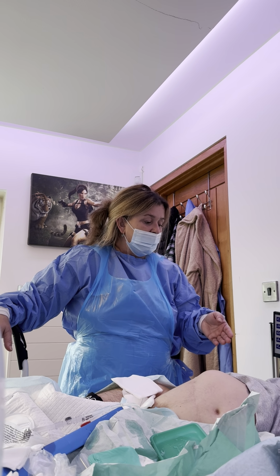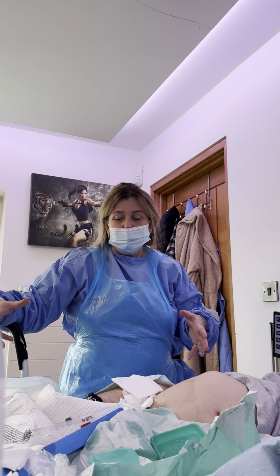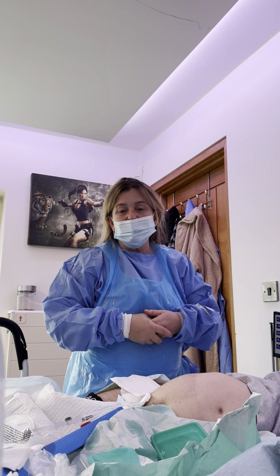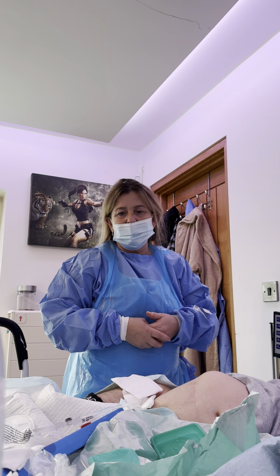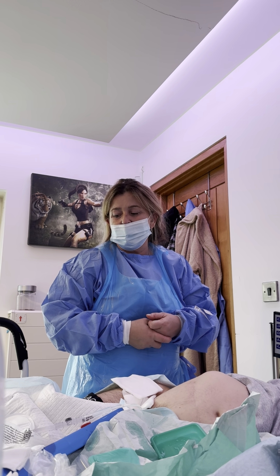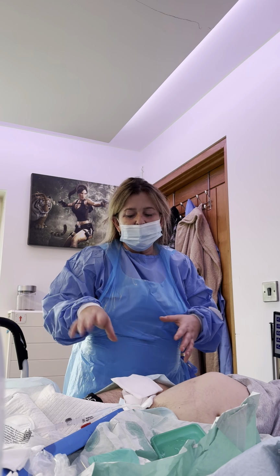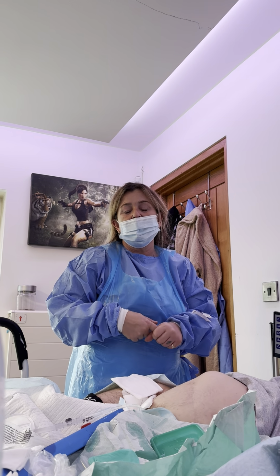Yeah, but the old silicone that you used, I can't remember the make. They got actually stuck, literally stuck inside. The latex, when he first became a spinal injury, they didn't know it was latex sensitivity, so that actually had to come out. And then I kind of insisted when we got to a hospital about 2 years ago, was it? For the Roosh, because at the end of the day, if I needed to double catheterize, I can use that to go up his winky woo as well as keeping the stoma hole open while we get into hospital.